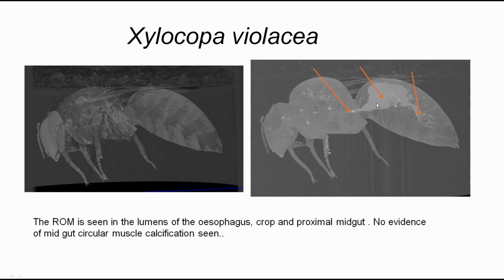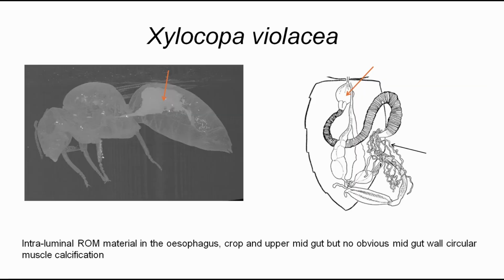Normally, wood has a relatively low attenuation, relatively at least to water and soft tissues, but there seemed to be no doubt where it was, and so presumably the carpenter bee was ingesting a certain amount of material for some reason.